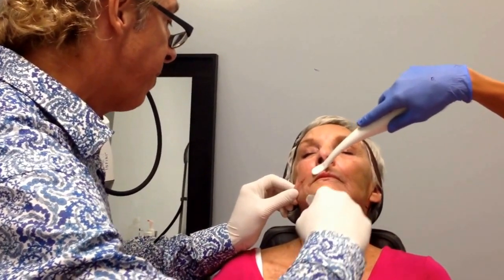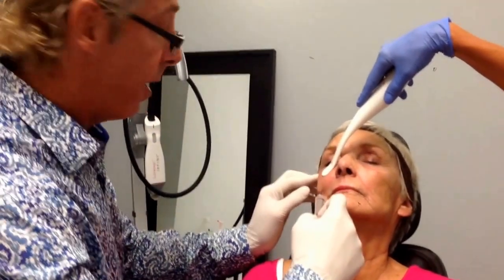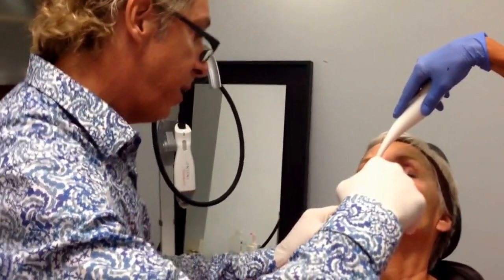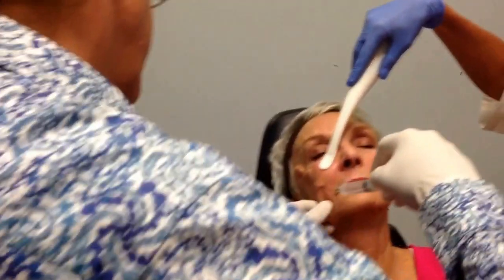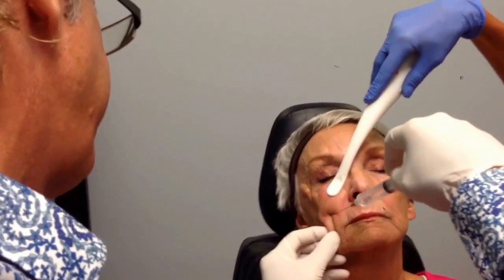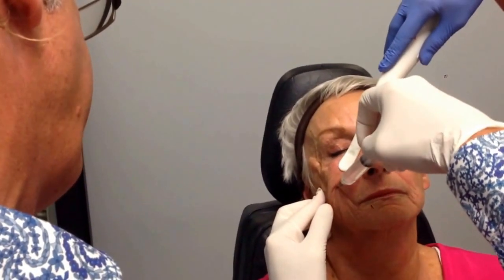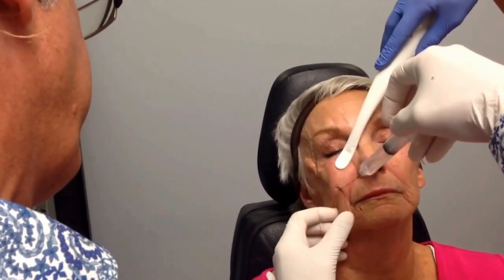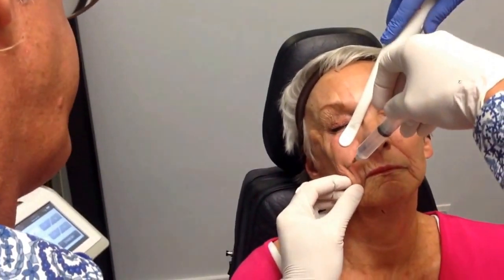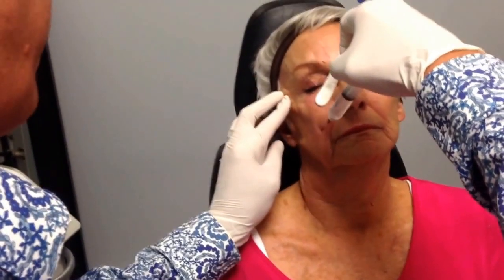And then I go over here and go all the way up to the temporal area. Do a little hole there. Then I come on over here so you can see. I come out and go over here to the great auricular area. I'm blocking that right over here, and I go down to the jawline — this is all through the same area. And I'm blocking that right there.